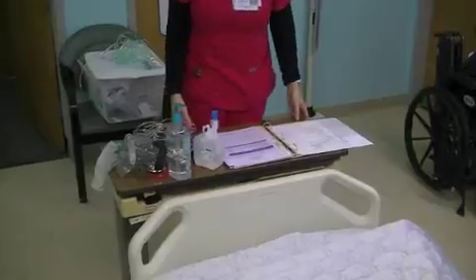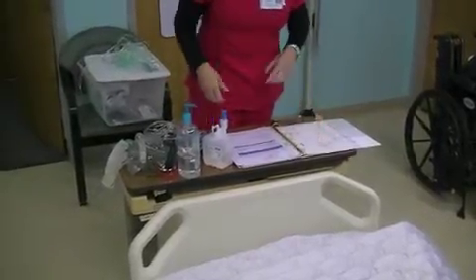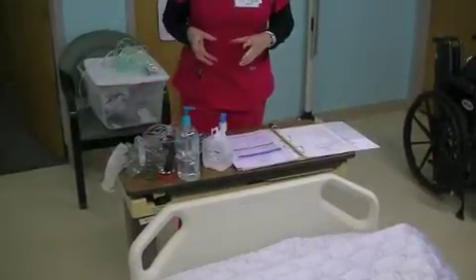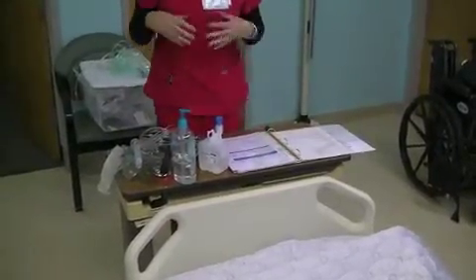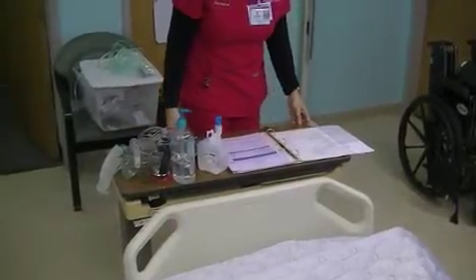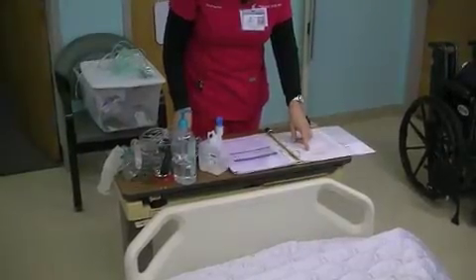I'm going to administer different oxygen devices, and one of the things you're going to do on your checkoff is you're going to have to know which device delivers what percentage of oxygen, because we're going to give you an oxygen percentage or liters per minute, and you're going to have to pick the right device for your checkoff. So make sure you get that correct. This order says monitor pulse oximeter every 2 hours and keep O2 saturation above 93%.